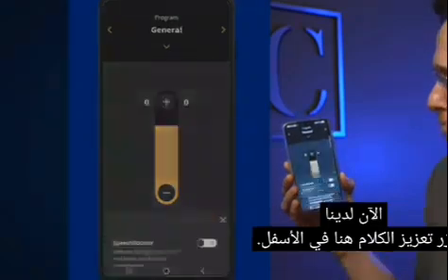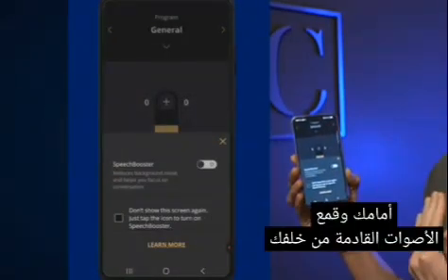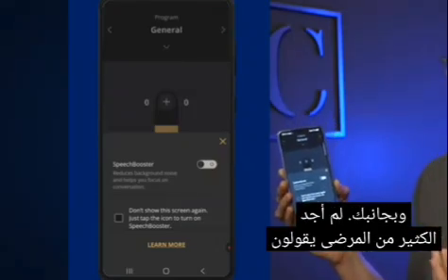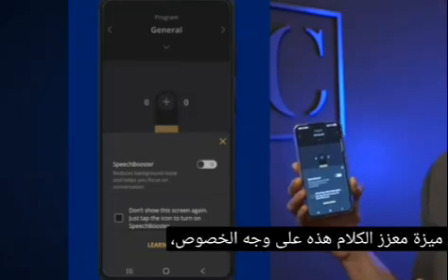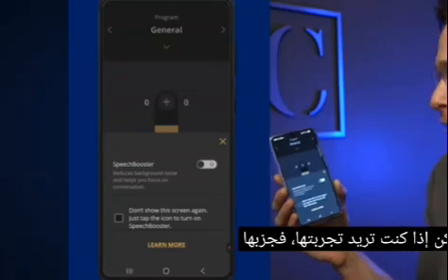Now we have the speech booster button down here. So speech booster basically boosts the speech coming from in front of you and suppresses sounds coming from behind you and next to you. I haven't had a whole lot of patients say that they've noticed a lot of benefit from this particular speech booster feature, but if you want to try it out, try it out.